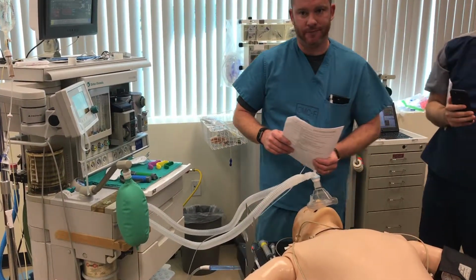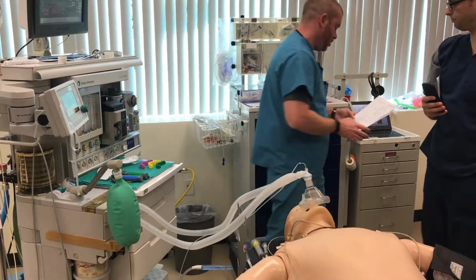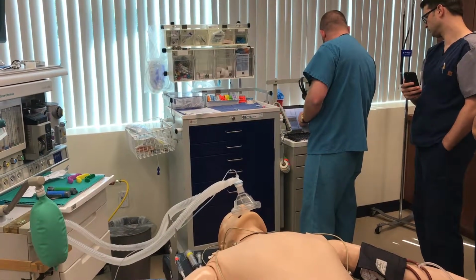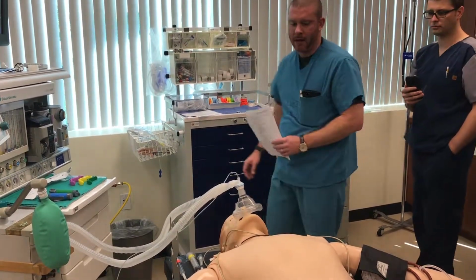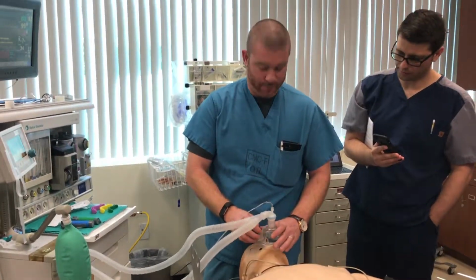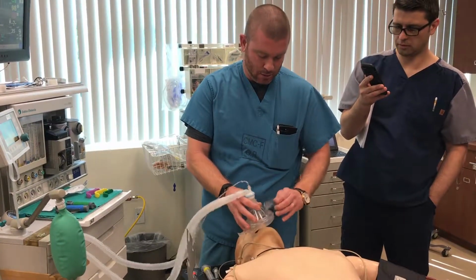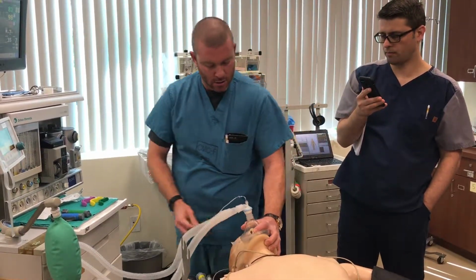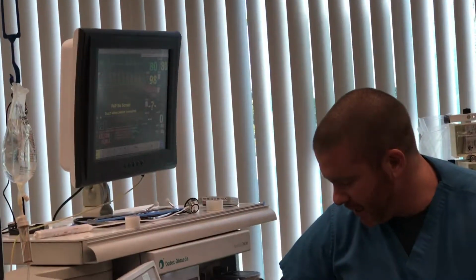Would I push a muscle relaxant? Not yet. Why? I'd be waiting, as it says here, for a loss of consciousness. Kind of relax, do the eyelash test. We will do that. So you'll notice he closed his eyes, checking lash reflex, and I will tell you it is gone. So then you'll pull the tape off the eyes. You're going to see an alarm up here in a second come off. You're going to try to establish an airway. My alarm's telling me he's not initiating respirations, right? I'm going to pause the alarm, consciously making an effort of that.